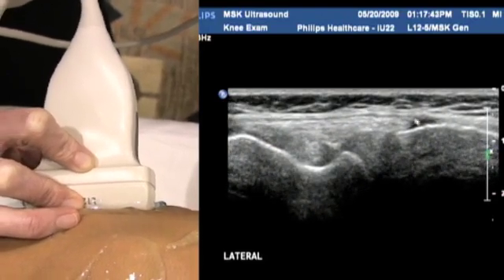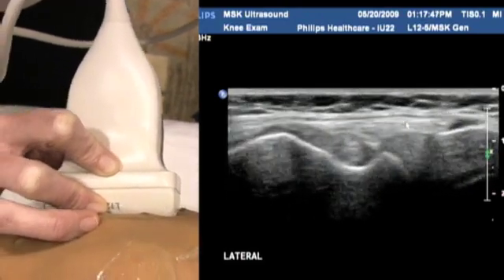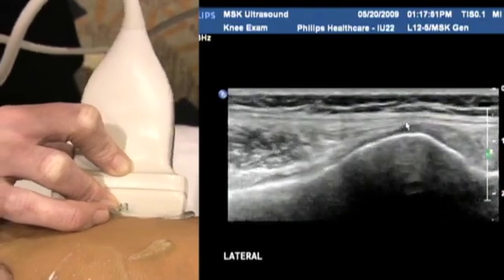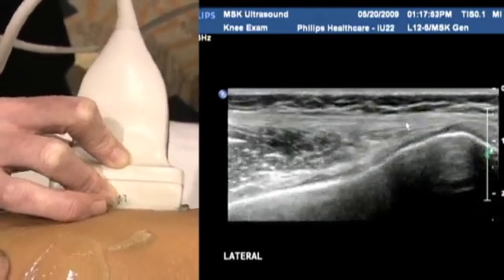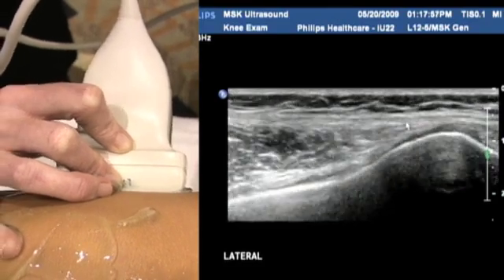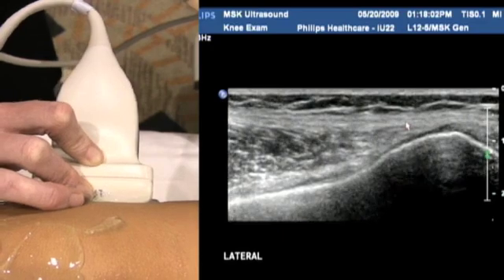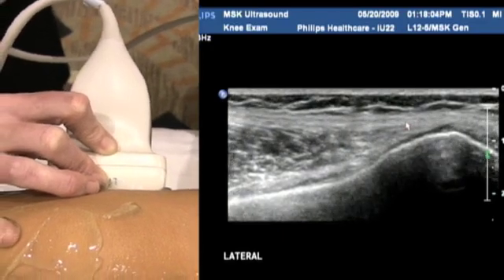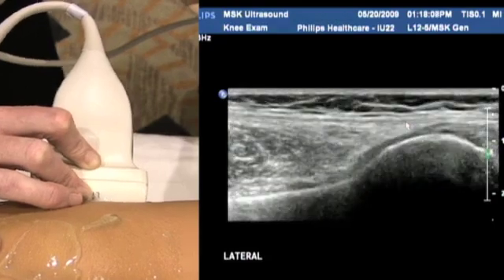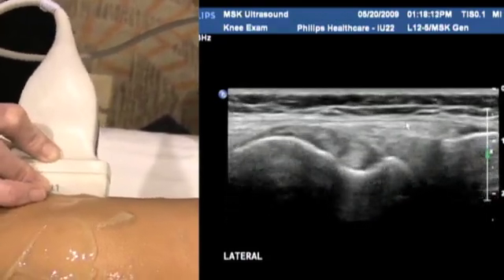Above that, you're seeing the iliotibial band. Again, this is a really long structure that attaches distally here at the knee joint, but extends all the way up and attaches onto the hip, in fact. So whenever you're assessing the iliotibial band, be really cognizant of patient history and make sure that you ascertain from the patient whether it's a distal iliotibial band problem or a more proximal iliotibial band issue right up by the hip. So make sure that you get as much information out of our patients as we possibly can.